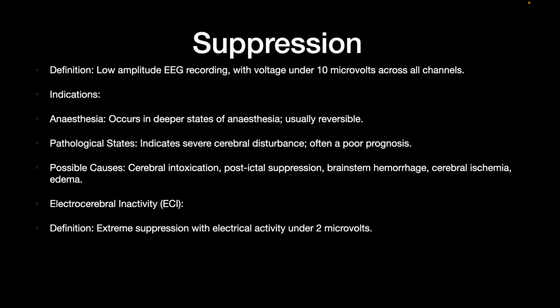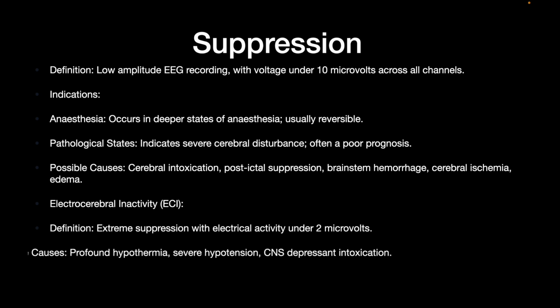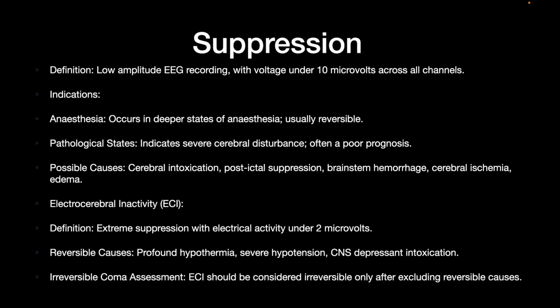Next is electrocerebral inactivity. This is extreme suppression of electrical activity within 2 microvolts. The cause is profound hypothermia or hypotension or the use of CNS depressant drugs. Irreversible coma in ECI should be considered only when you have excluded all the reversible causes.